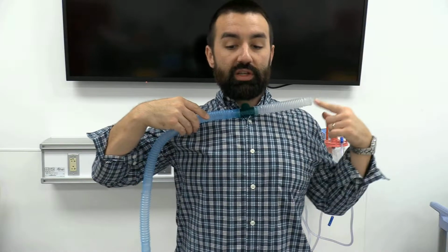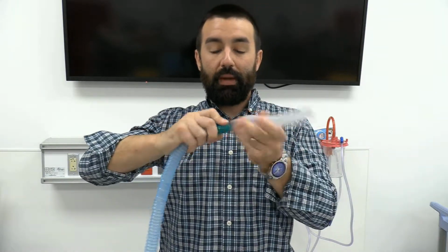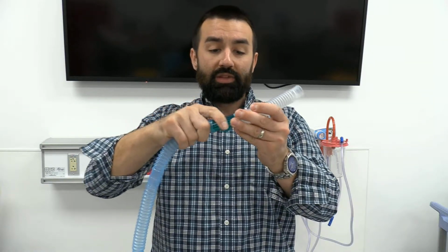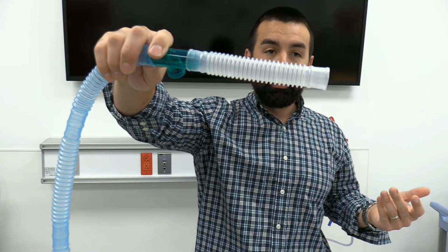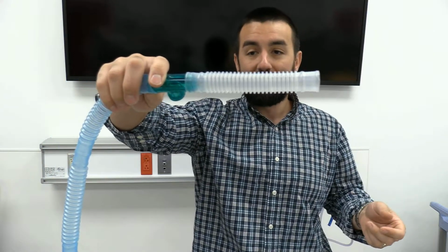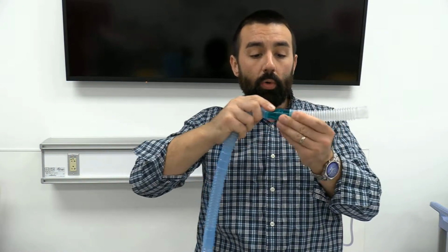That 6-inch flex serves as a reservoir. So just in case a patient briefly exceeds whatever flow you have coming out of it, we're housing another 50, 100 mils of humidified, high FiO2 gas or whatever we have set right here. So in this particular case, you've got a patient hooked up like this, and it's great. You have the ability to hook straight onto their airway. They're getting all the gases they're breathing. As they exhale, it shoots out the little port right here.